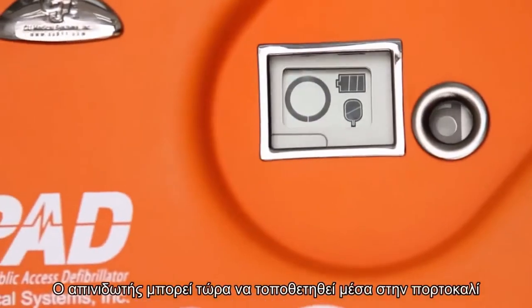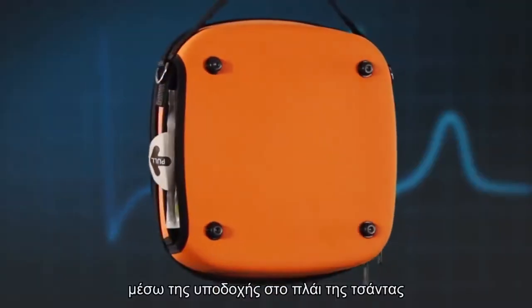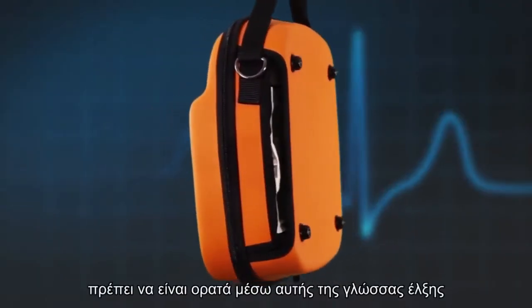The AED can now be placed inside the orange carry case. Gently pull the edge of the electrode pads through the slot in the side of the bag so that the pull tab is visible.